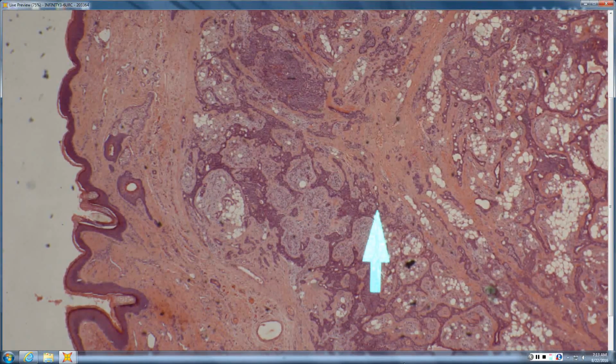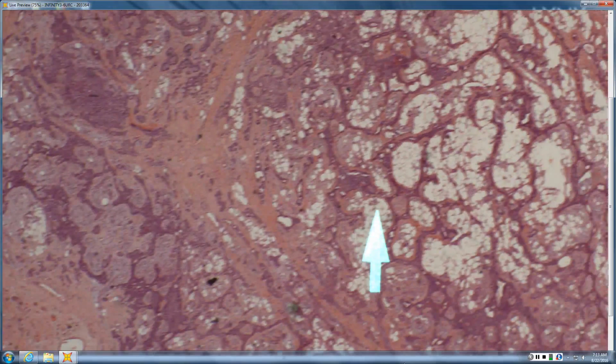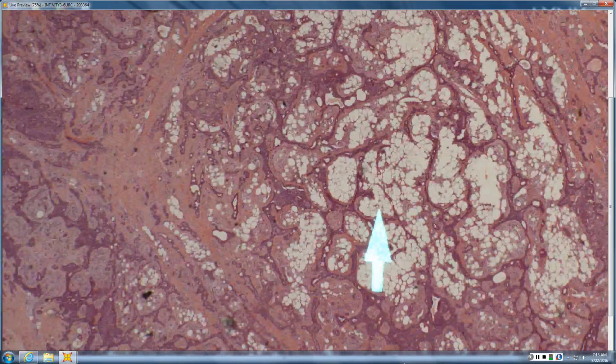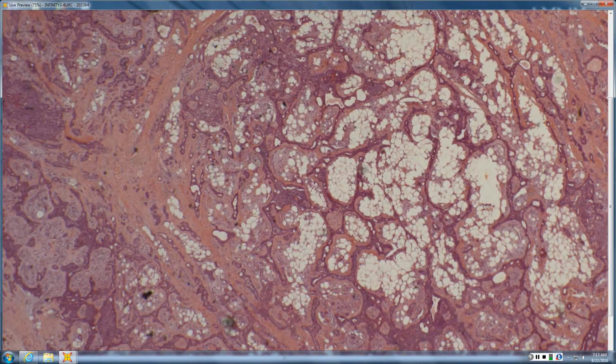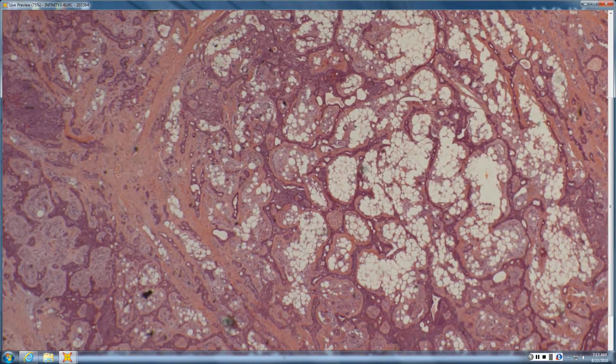So, oh man, this is probably just a mixed tumor, but why is all this fat in here? Well, remember, it's called a mixed tumor because you have the syringomatous component, and then you have the mesenchymal component, which can be cartilage, fibrous, fat, or all the above. So you don't necessarily have to have an entire thing chock full of that cartilaginous stuff. It's kind of a mixed bag. No pun intended.